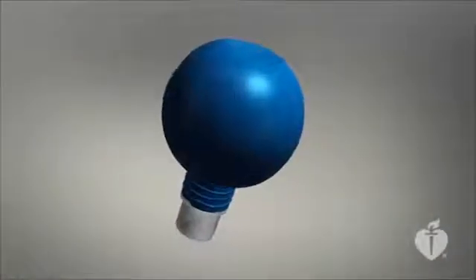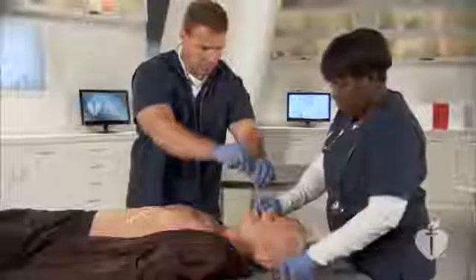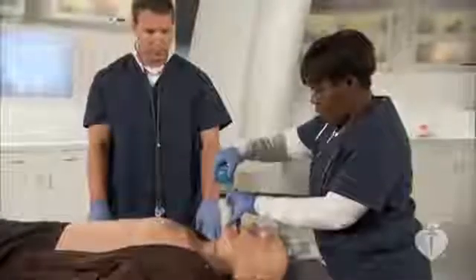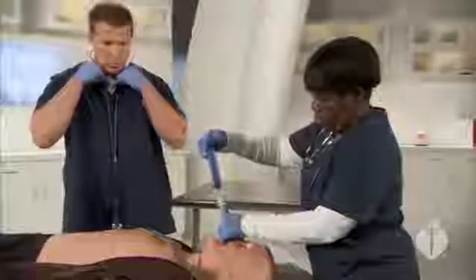One additional confirmation device is the esophageal detector device, or EDD. The EDD is a bulb that providers compress and attach to the endotracheal tube. If the tube is in the esophagus, then the bulb will not expand and fill with expired CO2. Another model is a large aspiration syringe attached to the tube. If the endotracheal tube is properly placed, providers will have no difficulty retracting the plunger. Esophageal placement will prevent plunger movement. Studies show that these devices are no more effective for confirming tube placement during cardiac arrest than clinical observations that include chest rise and bilateral breath sounds.